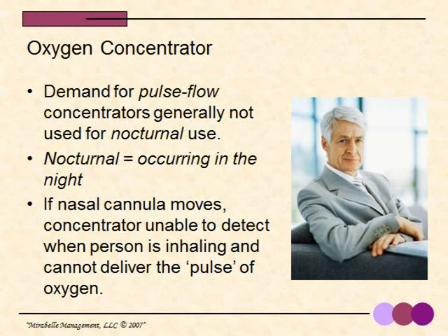Historically, pulse flow concentrators have not been used for nocturnal use or for sleeping. If the nasal cannula moves such that the concentrator is not able to detect when the person is inhaling, it is unable to deliver the pulse of oxygen while the person is inhaling. Next, we'll have a video clip showing our nurse filling a very small portable oxygen tank from the oxygen concentrator. Plus, I have stated some safety tips to be mindful of when you're working with oxygen.